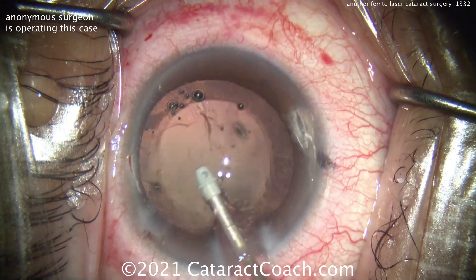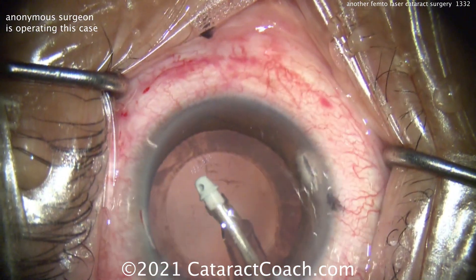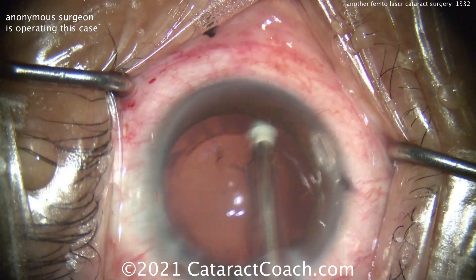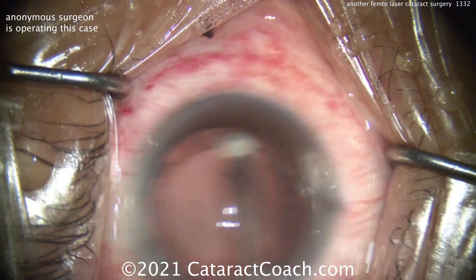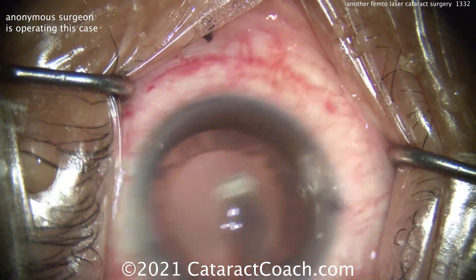And is the laser helpful in a really dense brunescent white cataract? Well, no. Think about it — if the laser can't get through an opaque lens, if the lens is absolutely opaque, well, the laser is just light. It's not going to penetrate that.